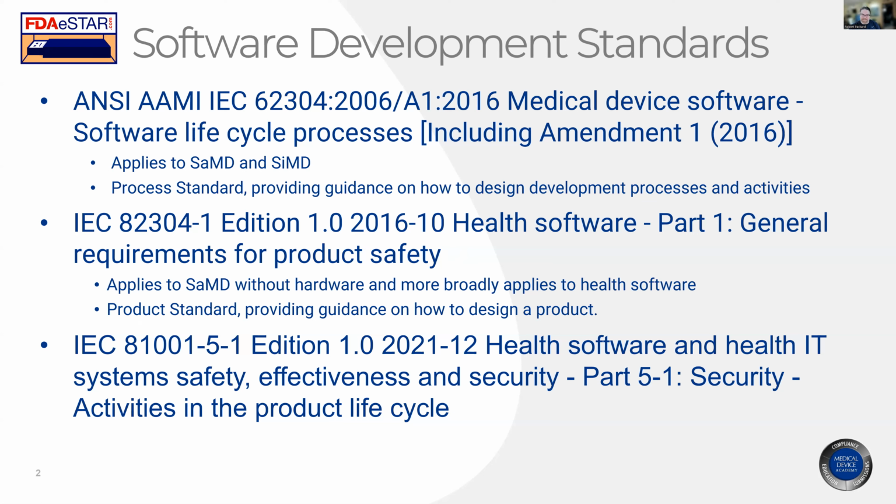Number two, you have IEC 62304 and you have IEC 81001. There are all kinds of other networking standards out there. There are security standards. There are cybersecurity standards and guidance documents. We can't go into all of them, but the most important of all of them here is 62304.